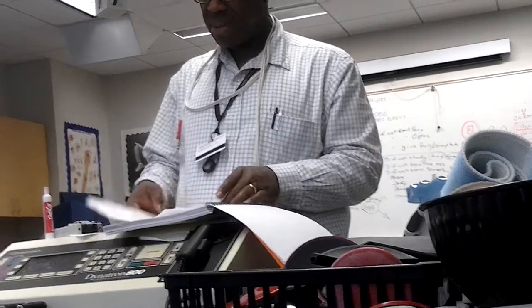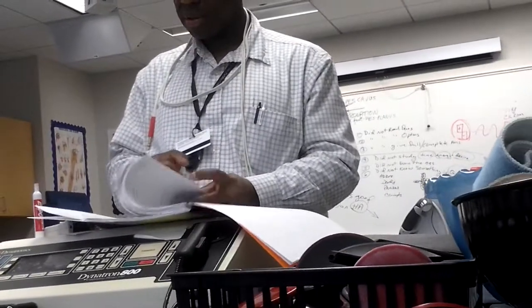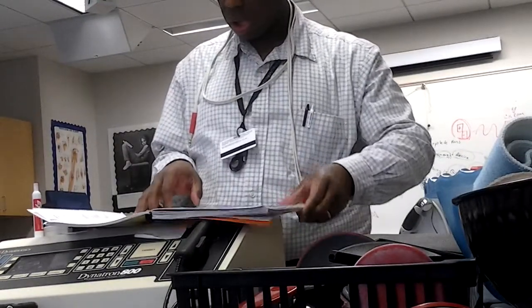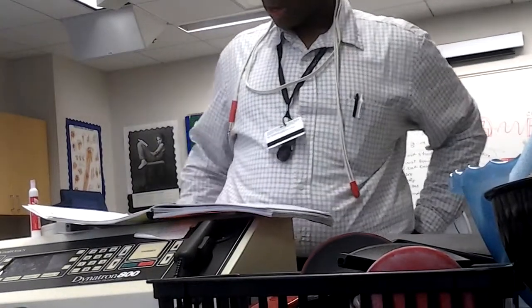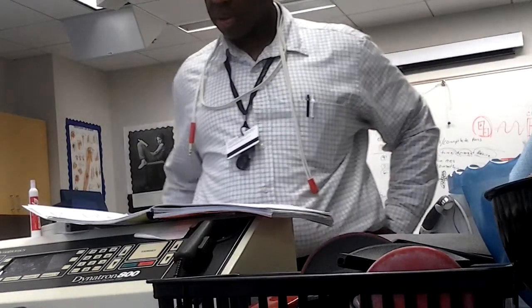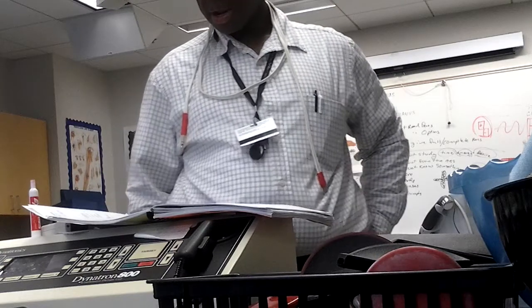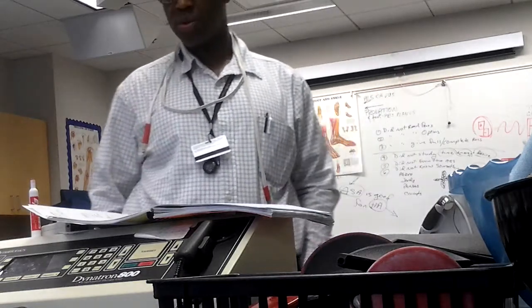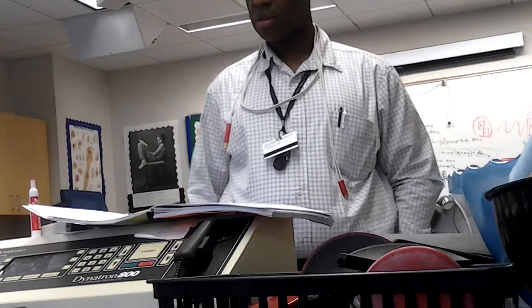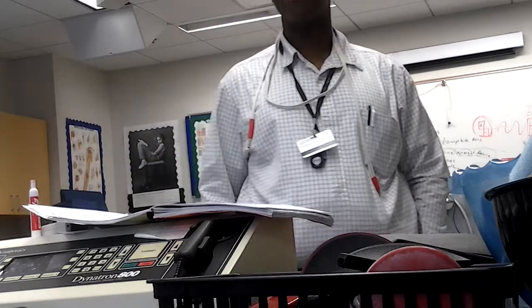Okay, page 70. Let's go to page 70. Probably answer some of this. Let's look at number 13. If a patient is set up with 2 equal-sized electrodes on channel 1 of a biphasic machine, what will the patient feel when it's on continuous?